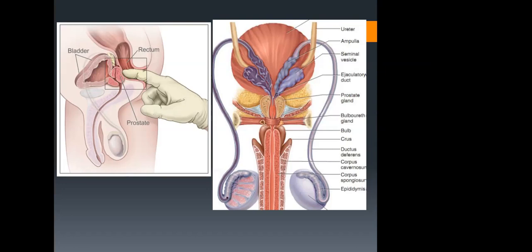But the urologist told me, Vitus, this prostate doesn't appear to be enlarged. I have done a digital rectal examination, but it doesn't appear. Could you review your images? And indeed, when I reviewed my images, it was not enlarged. It was over-extrapolated calipers.